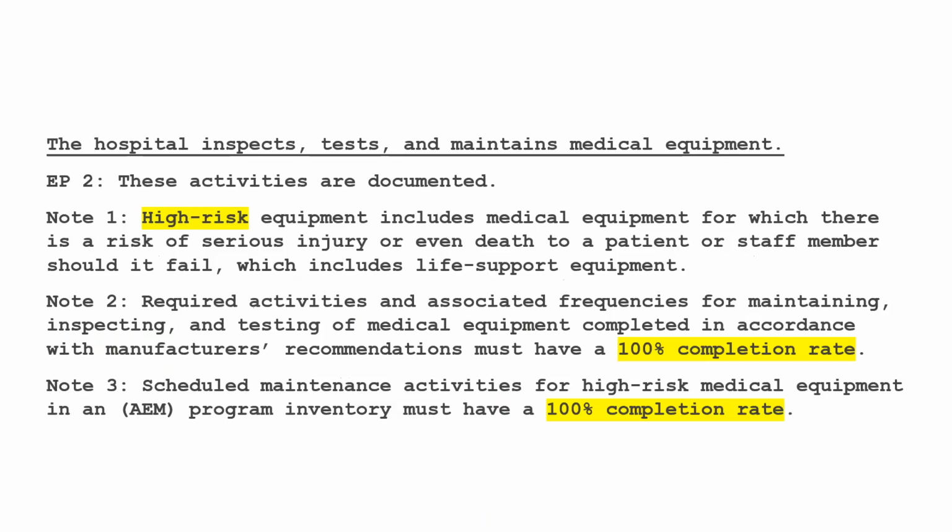You also need to test and maintain this medical equipment. There's some testing around high-risk equipment. High-risk equipment is what you decide is high risk. That's the fun part of this whole thing about your requirements. You get to decide your formula for picking and scoring what falls into high risk. It's like a test you have to pass to get it right. So you score the equipment with whatever strategy and criteria you have. That's usually in your hospital policy on what that looks like.